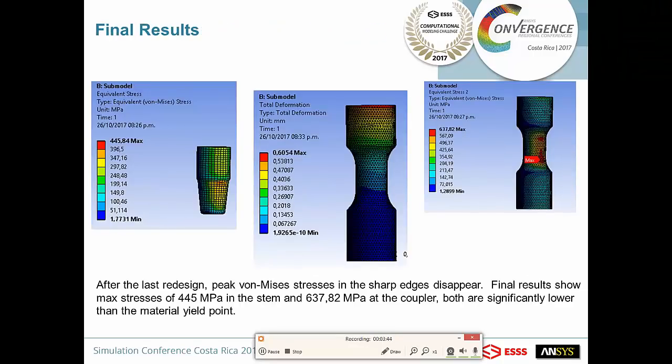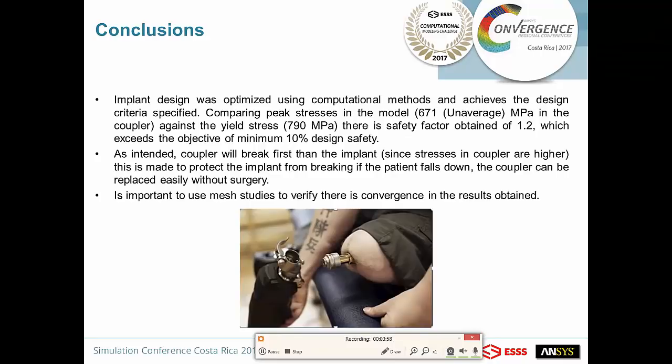And finally, we have our results. In this case, we can see that we have a really lower stress in the stem, and the project is ready, and we have these conclusions.